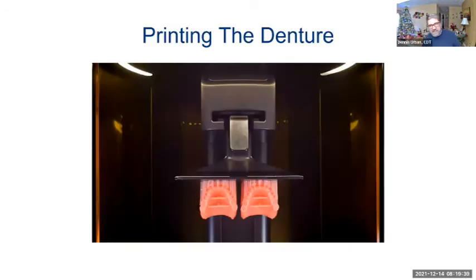So that everything looks good, we're ready to go ahead for the final denture. We either get a call from the doctor or the doctor sends the case back, and we're ready to print the denture. And I'll show you how we do this.